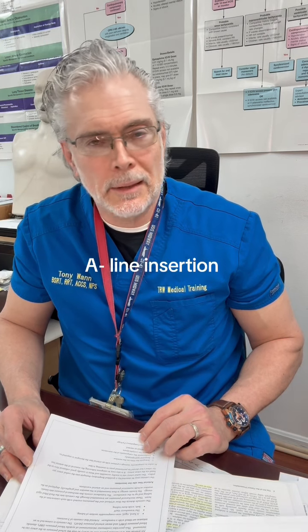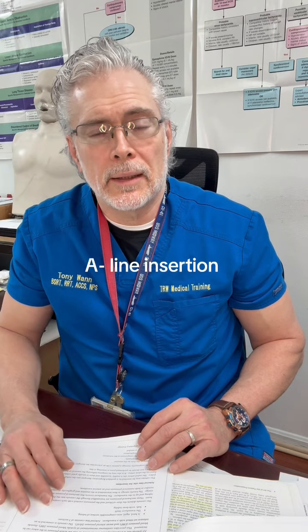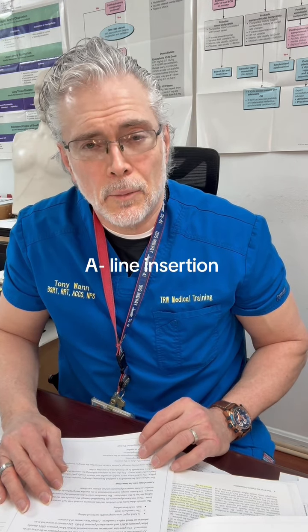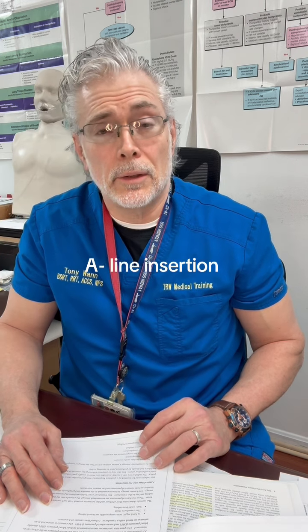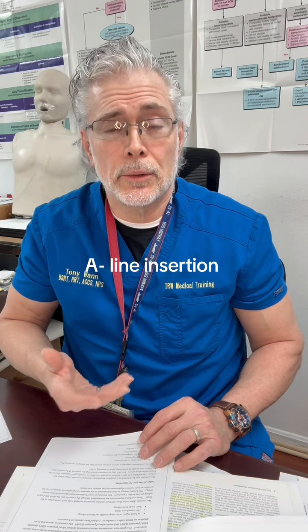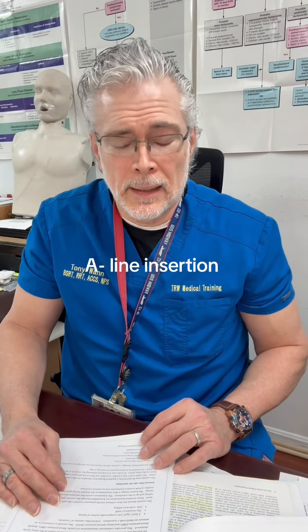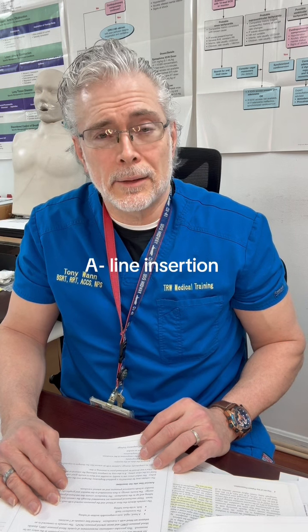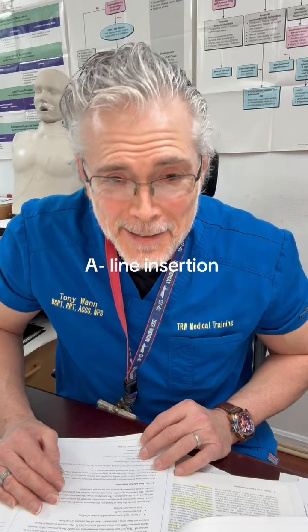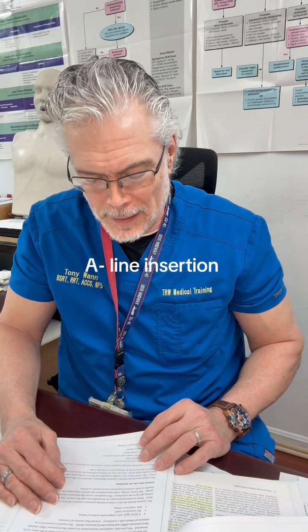So we'll talk about the invasive monitoring. We're going to talk about the sterile preparation of the A-line. We're going to talk about the type of catheter, over the guide wire catheter insertion, how to secure it, how to securely tape. I was taught how to secure with needle and thread, and also tape. I do both. So if you pull one of my A-lines out, you probably pull the shoulder off too. I'm just kidding, but it's very secure. I can teach you how to do that.